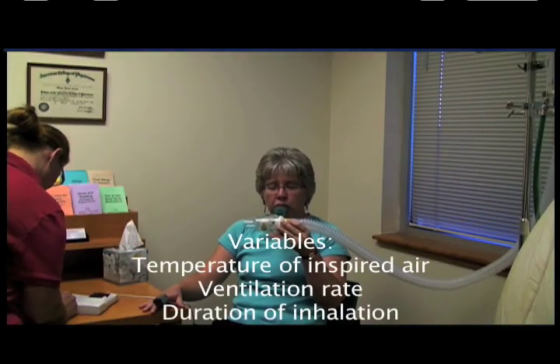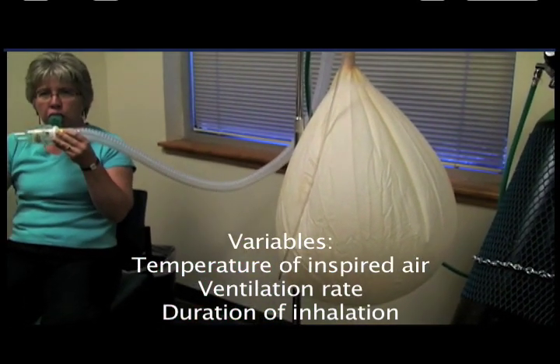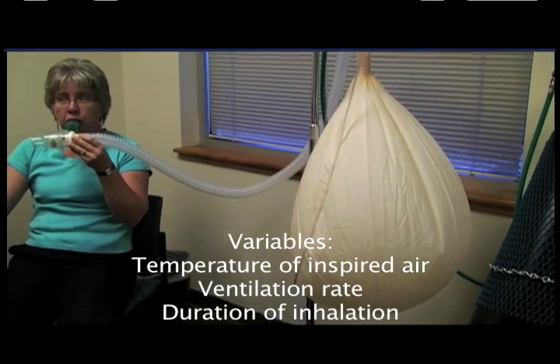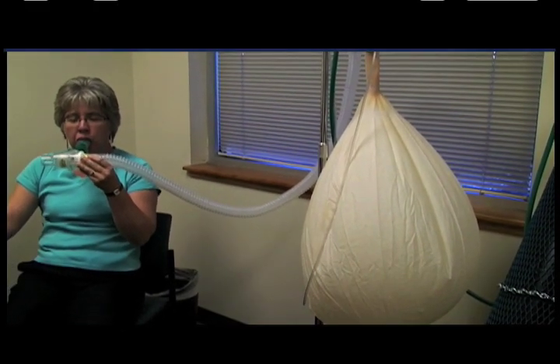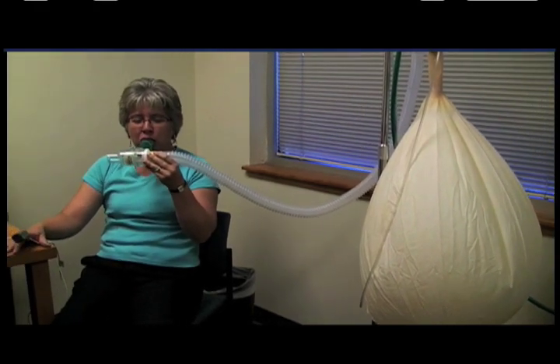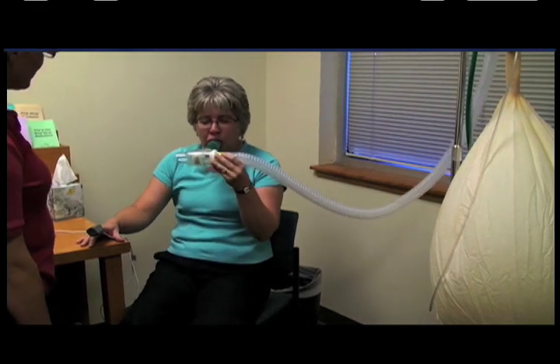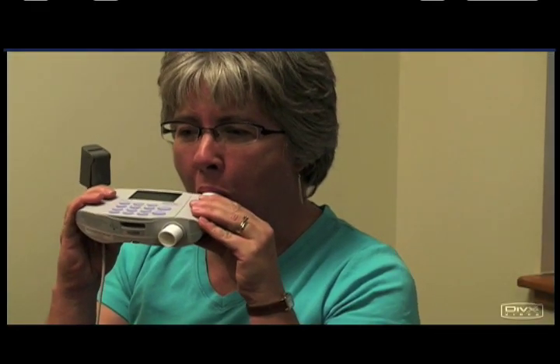The following may be adjusted in performing this test: the temperature of the inspired air, the ventilation rate at which air is inspired, and finally, the duration of inhalation. In this example, the patient is performing the test submaximally. In contrast, competitive athletes, especially highly trained competitive athletes, may be pushed to the limit in performing the test.